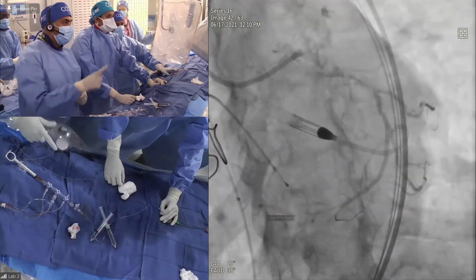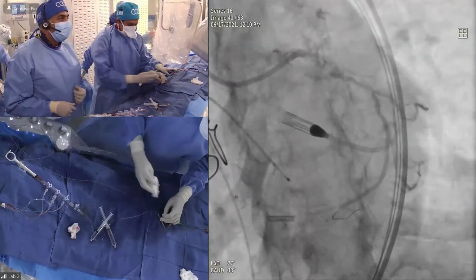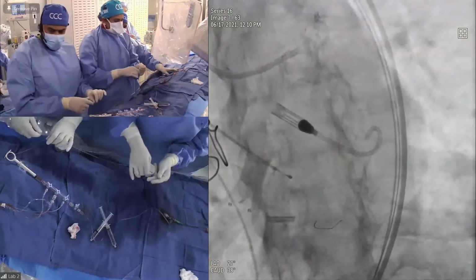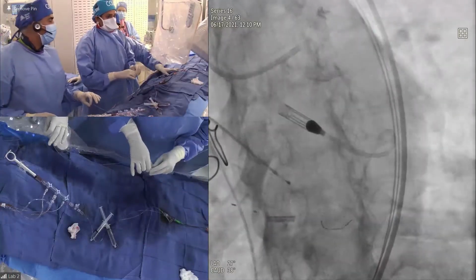We've got to redirect the wire. And that's very easy to trap inside. Okay. Leave it. I don't do anything. Okay, one fiber. You want assist? It was not easy. Stepping up and down to the next level, I don't know, I'm a little worried. What do you guys think?